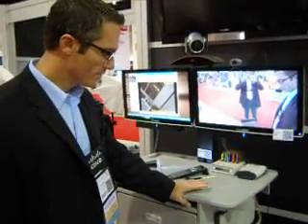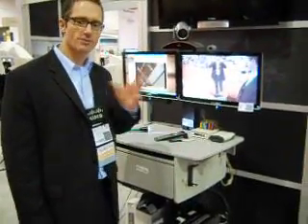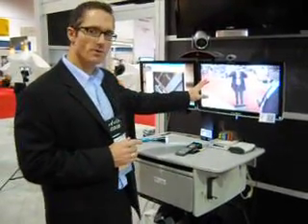And Jay, this cart looks like it would be set up in a hospital setting or a clinic, maybe an outpatient physical therapist clinic? Exactly. This would be positioned at a clinic somewhere, and then you can connect back to your physicians. You can either have a physician, a mid-level, and they can be reviewing that, and the far end, again, who's doing the actual specialty consult, can discuss with the patient.